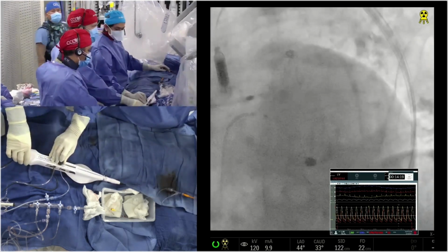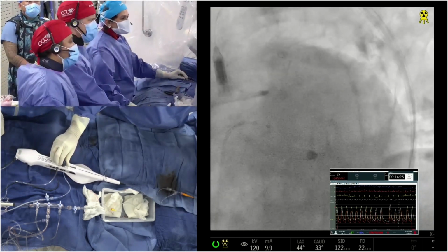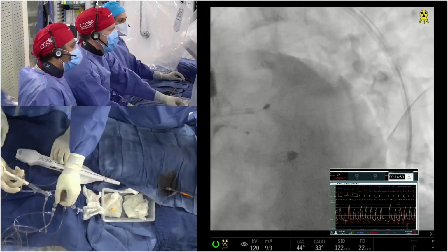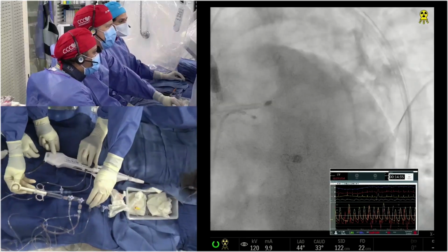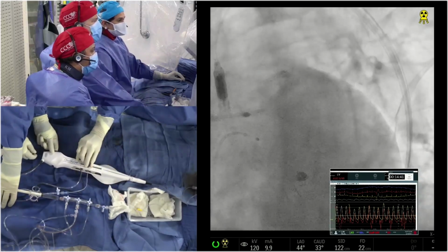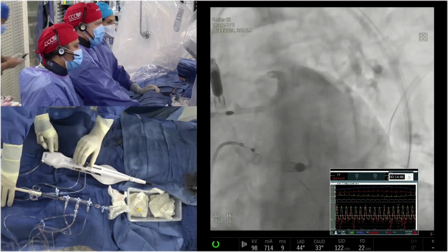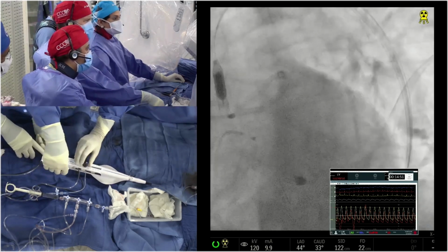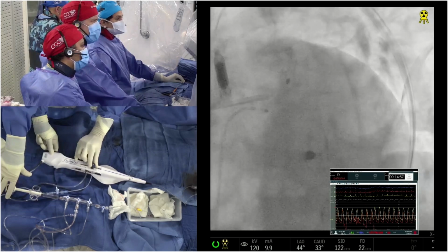Jazz? Yeah, no, I think lithotripsy here is easy to cross. You can do lithotripsy here or rotational atherectomy. The only thing in this scenario is, you can cause bradycardia and hemodynamic changes. And if you were to really perform atherectomy, it is hard to cross 360 degrees of calcium. Orbital may be better tolerated in this, because of the way the mechanism works, and it allows blood flow and less bradycardia, so orbital sometimes is better tolerated in these scenarios. But I think short lesion IVL, IVUS-guided IVL sizing should do the trick, I think.